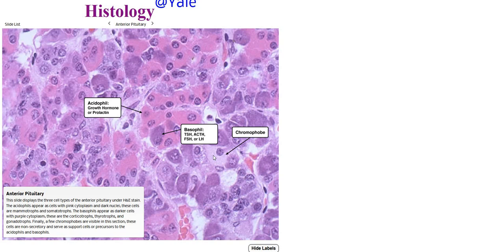I just want you to be able to recognize, if you were given the information that this is part of our pituitary gland, that this is anterior pituitary. We can tell that because all of this tissue is cellular. We're back to those cuboidal cells, that repeating pattern over and over again. So that is how we know this is anterior pituitary. This is producing many, many hormones. We're not really going to talk about them in this class, but just keep this information in mind if you do go on to take physiology.